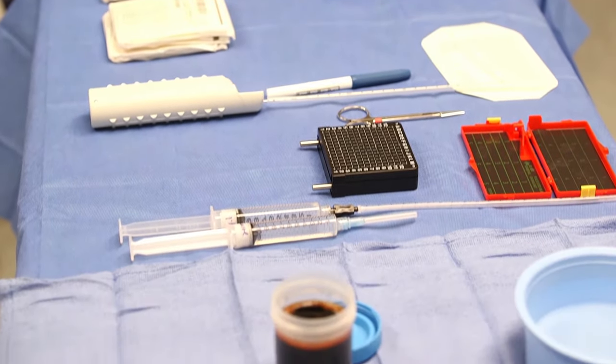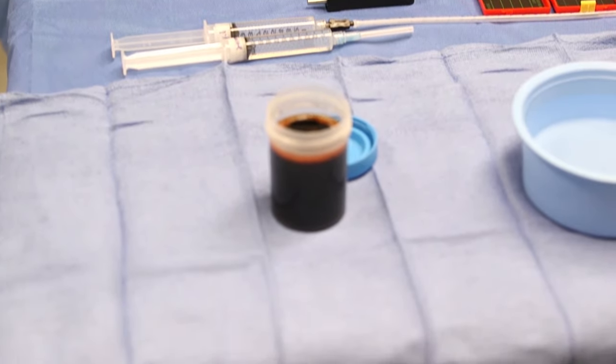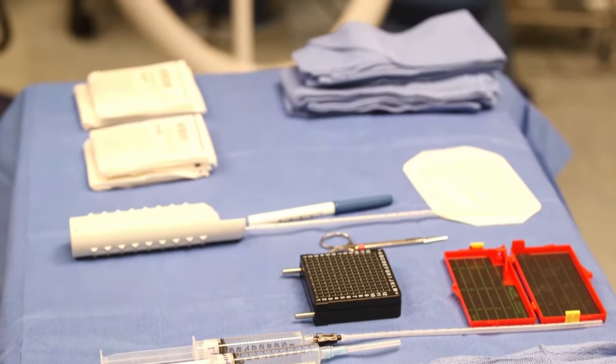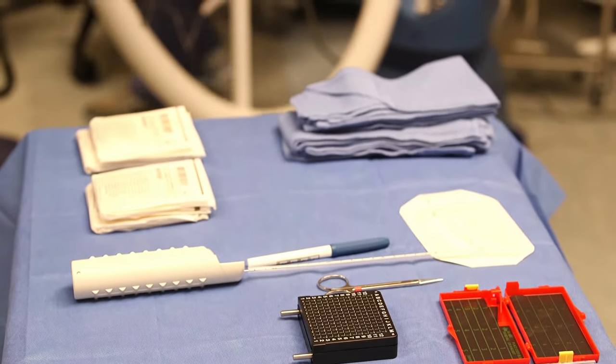The back table setup includes sterile gloves, blue towels, biopsy gun, grid plate, 1% lidocaine with an 18 gauge needle and chiba needle, cup of betadine, bowl of sterile water, and Tegaderm dressing.